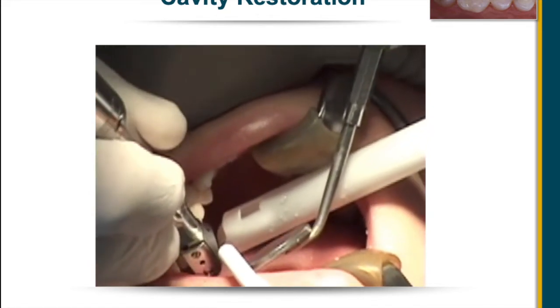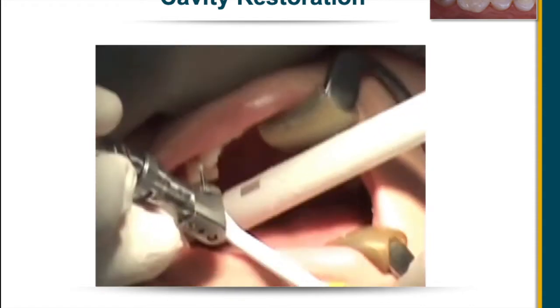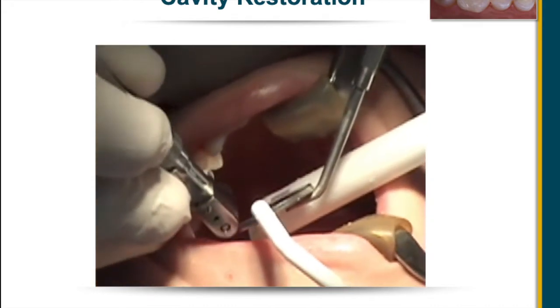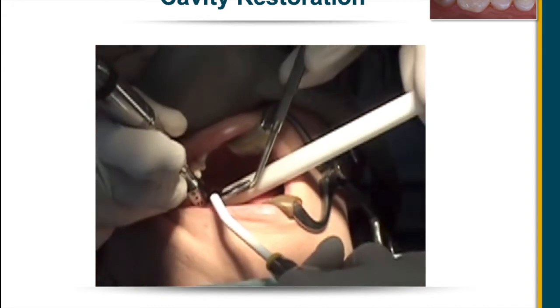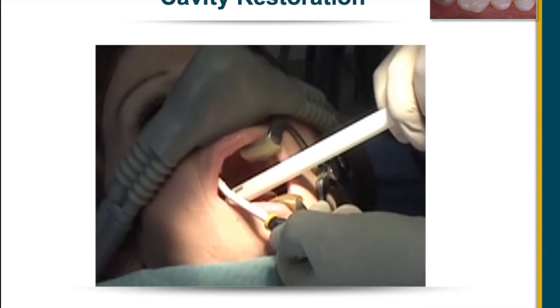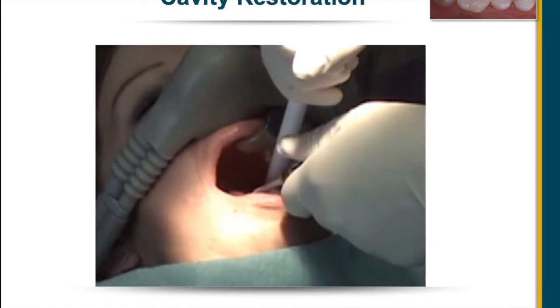The low-speed handpiece presents a considerable amount of vibration inside the patient's mouth, so it is often good just to say to the patient, a little bit of vibration here, and that gives them a general warning that there's going to be some bumpiness associated with the low-speed handpiece. We often use the words, "This is Mr. Bumpy" with the children, and that helps them understand that he's a little bit of vibration. Again, once the doctor leaves, the assistant must immediately rinse and dry the preparation, suction for the patient, and then they can leave the mouth.